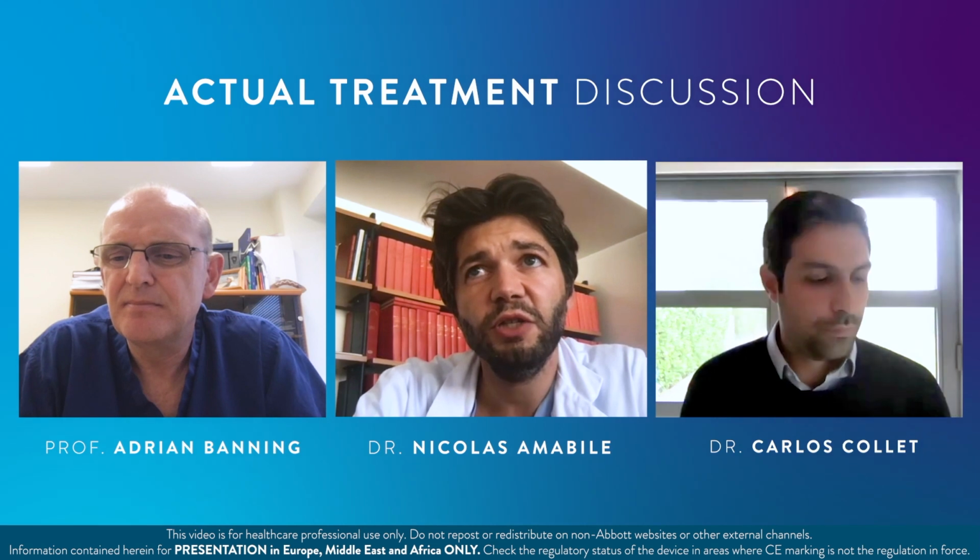Of course, in this case, this is a stable patient, so we treat him with a drug-eluting balloon and drug-eluting stent, and 6 months might be enough according to the European guidelines. On the other hand, it is a bifurcation, so there is a high risk for a recurrent ischemia, and so we could potentially consider longer DAPT, especially because the bleeding risk of this patient is quite low.